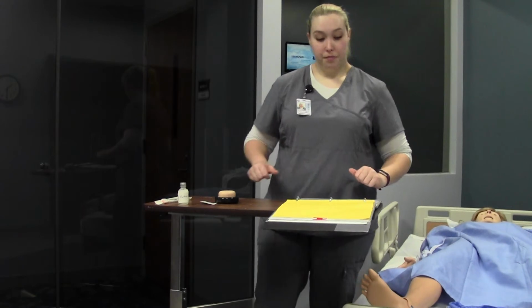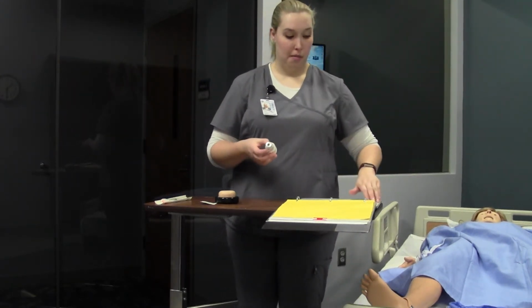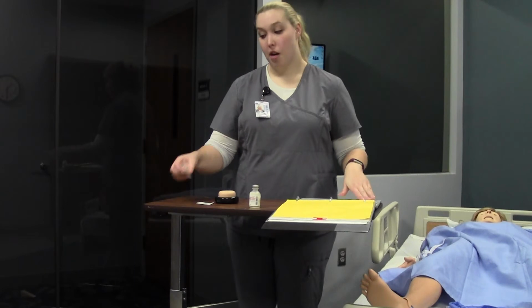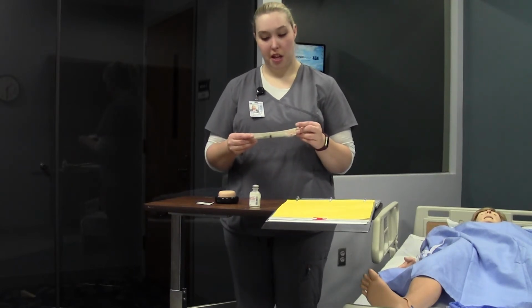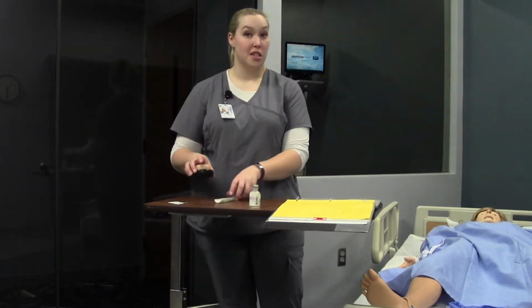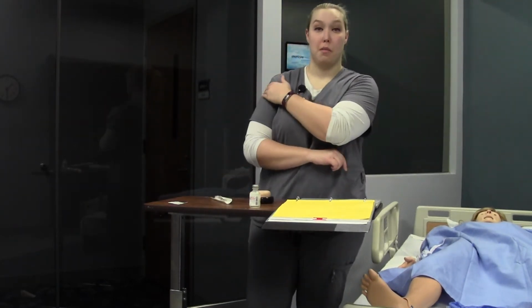Make sure, I'm going to do my check again. So I have morphine, 2 milligrams per mil. My MAR says I need 1 milligram or 2 milligrams, and I'm going to give 1. So I've got my medication, I've got my MAR, I've got the correct needle. So what I need is a 3 cc syringe with a 25 gauge, 1 inch needle. It's going to look very similar to a sub-Q needle, but you're going to need the longer one to make sure we get down to our muscle.